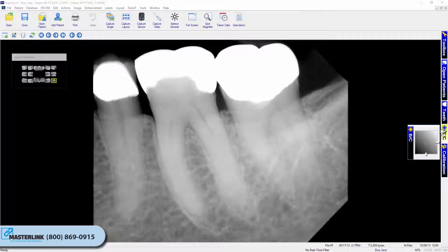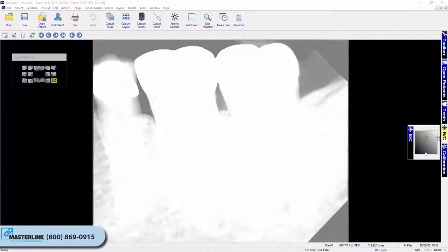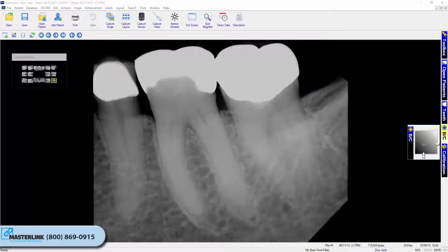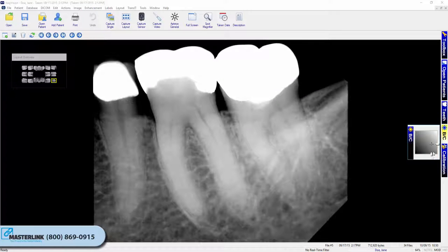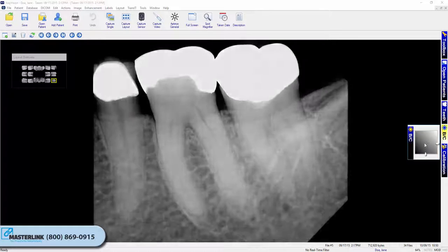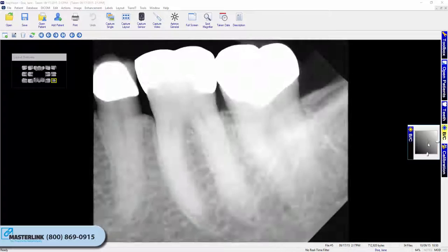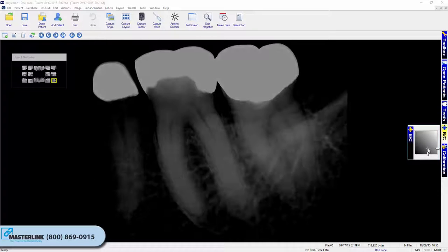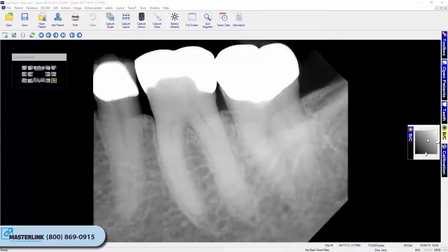It will be grayed out if a true color image is displayed on the desktop. To adjust brightness and contrast, click and drag the sliders located on the right side for brightness and bottom for contrast of the tool, or click and drag the crosshair located in the center of the control box. To reset the Brightness Contrast back to its original setting, right-click or double-click on the control.